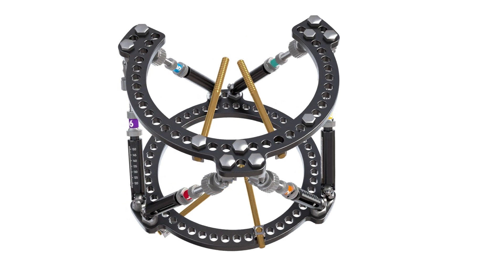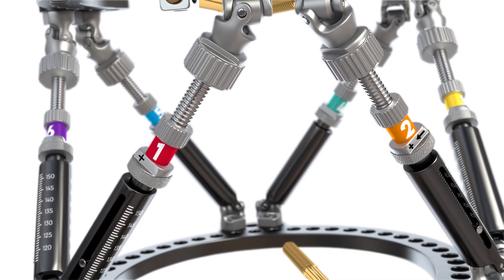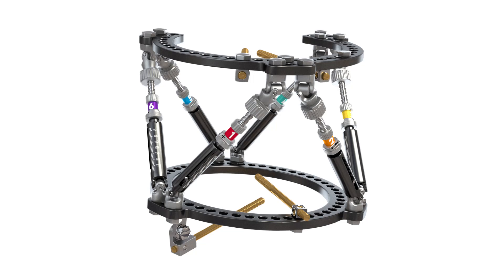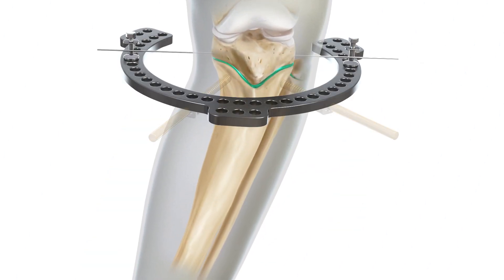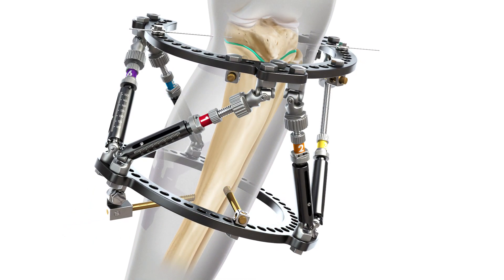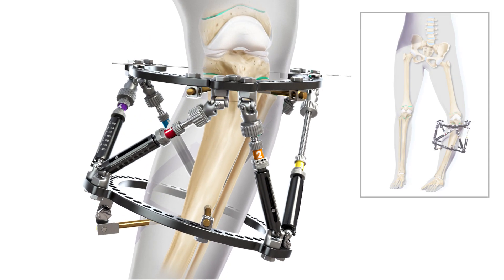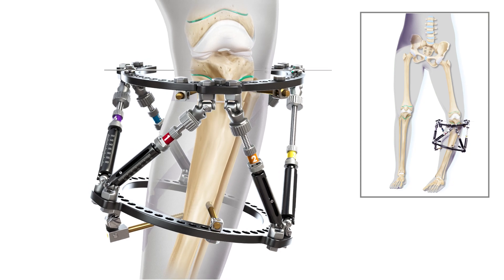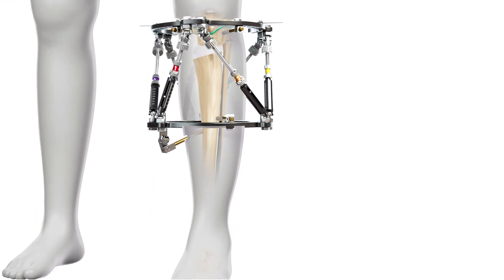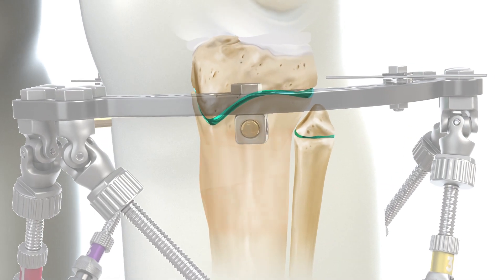The hexapod device consists of rings, adjustable struts, and pins. The struts are numbered, and each can be lengthened and shortened to move the rings in multiple planes. Your surgeon will position pins into the bone, and the rings and struts are connected to the pins. Your surgeon will make a cut, or osteotomy. The struts on the hexapod are adjusted small amounts daily, using a chart developed by a computer program set for you. Once the bone is corrected, the hexapod remains fixed in place until new bone tissue hardens and heals.